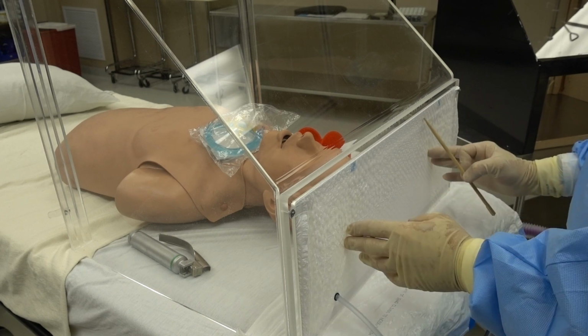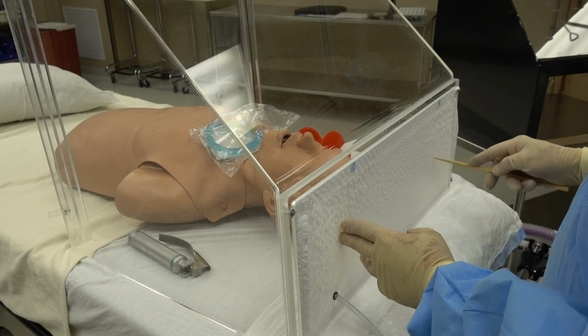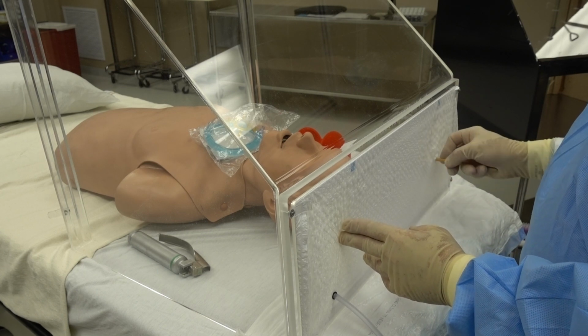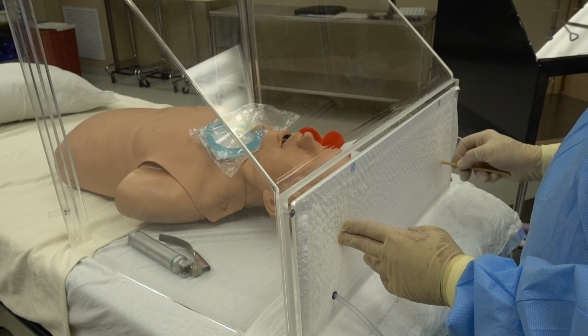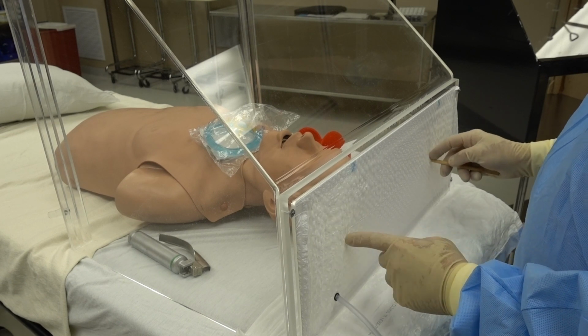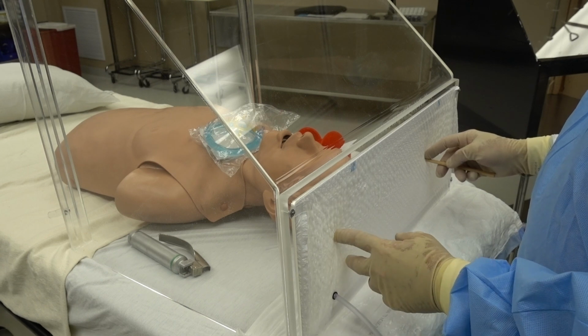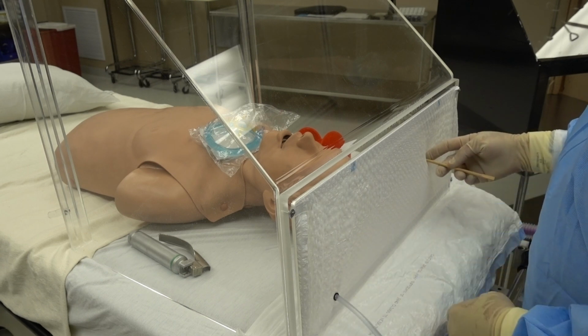So again, look where you want your penetrations to be. You put a hole straight through. Again, it would be better if this was a little bigger, but you can do it with any size hole. You can make it a little bit bigger just by doing that, but you want a round circular hole. And again, an 8 or 8.5 trephine would work great. Probably a biopsy punch, something bigger, this would be better.